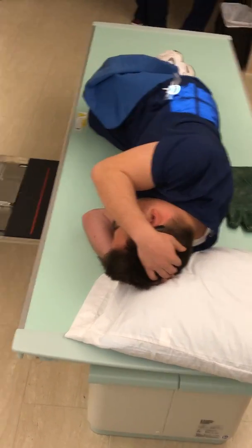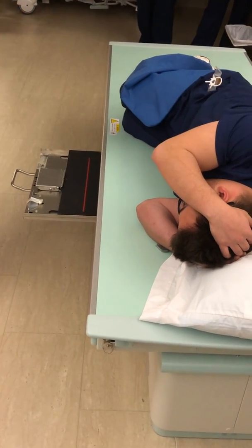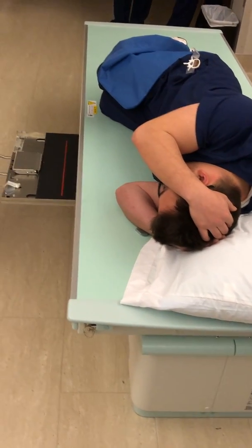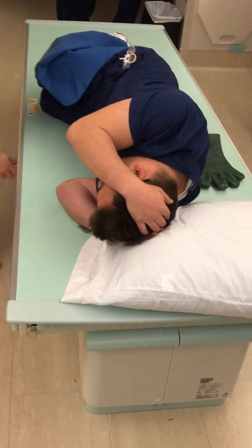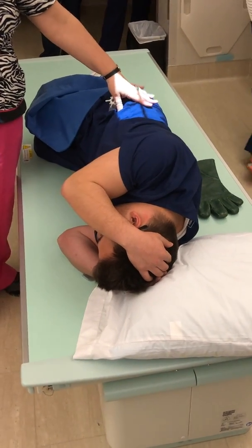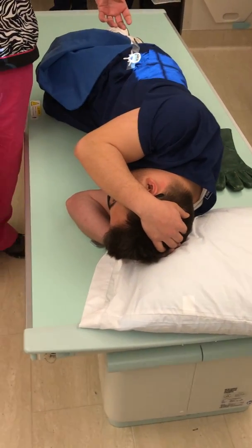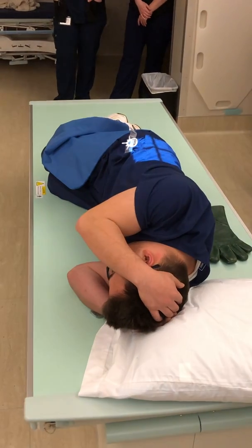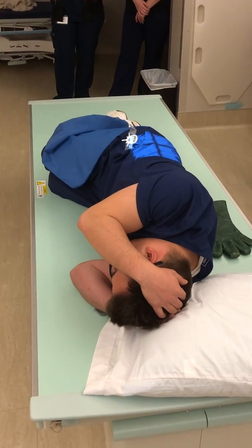I do need to make sure that my bucky is in alignment, because once you angle the tube, you have to realign your bucky. That's going to be probably the number one mistake for cause of repeat here. Again, I'm going to go up that little bit in kVp because we're now penetrating through both wings of the pelvis as well as the density of the spine. We're in alignment. Blow all your air out, hold it out, and breathe and relax.